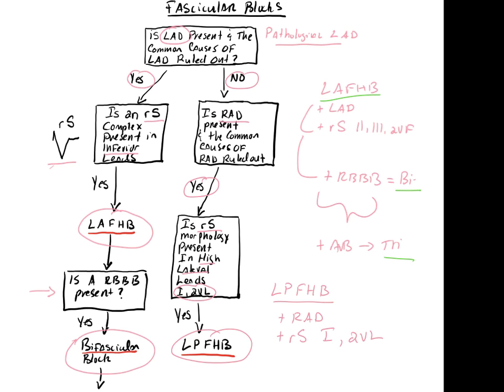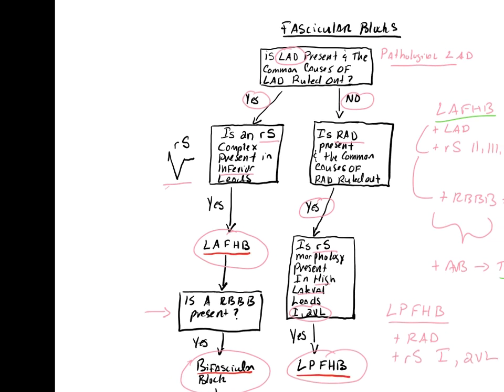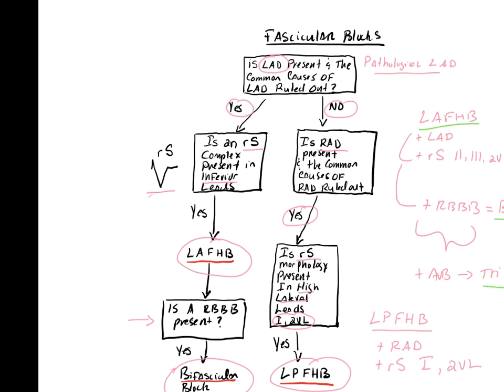Are you guys okay with that? Okay. The next thing that we need to be aware of is if we have axis deviation, before we go down this pathway, we need to rule out the common causes.